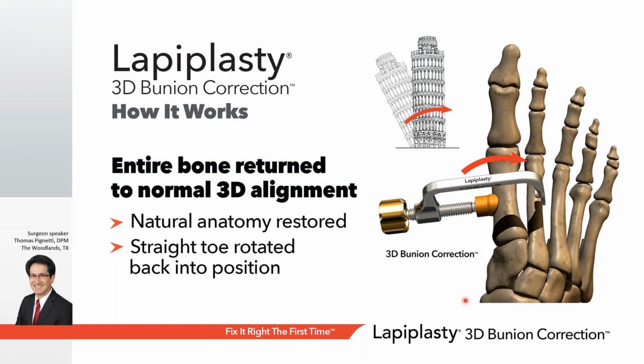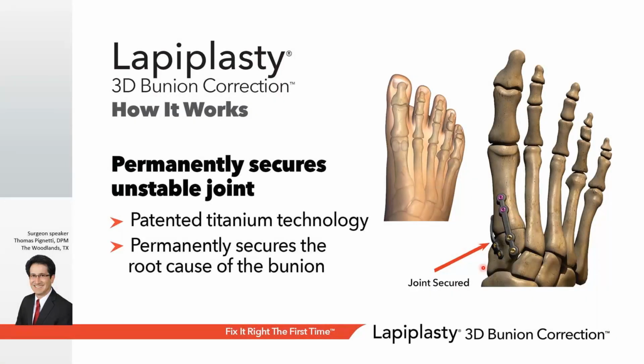So we can actually see this is exactly how we want the bone to end up at the end of our procedure. We've not done anything permanent yet at this point in the procedure. There's then other instrumentation that's not shown here that gets placed over that unstable joint. And there are little slots in that instrument that allows us to make the cuts very precisely and very predictably, where we remove just little slivers of bone that include the cartilage on either side of that joint. And it's once that cartilage is removed that we can then secure these two bones together and apply our hardware, our fixation, our plates and screws, permanently sealing it in that place.